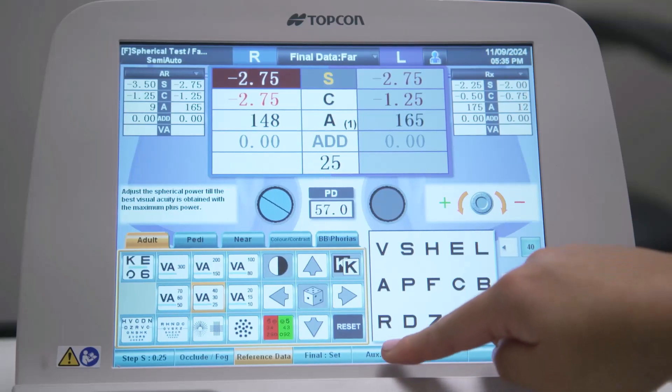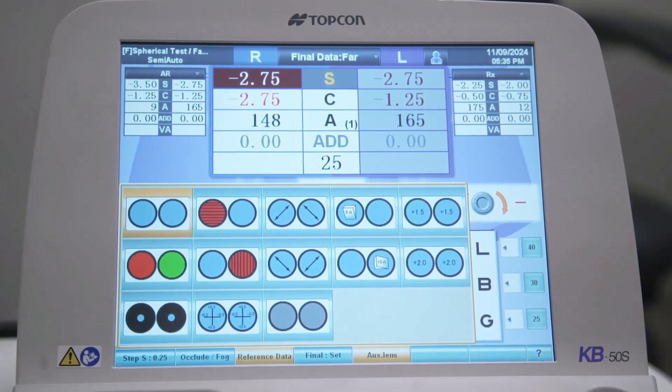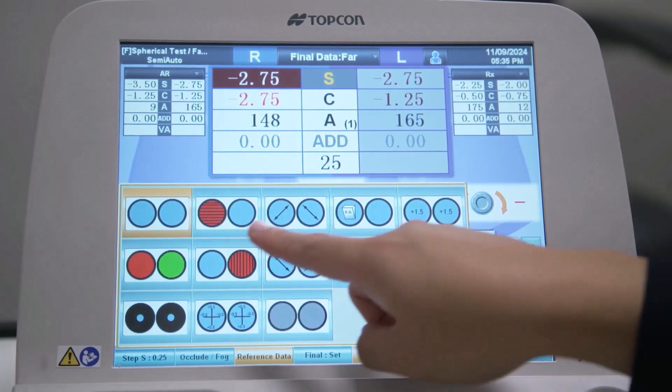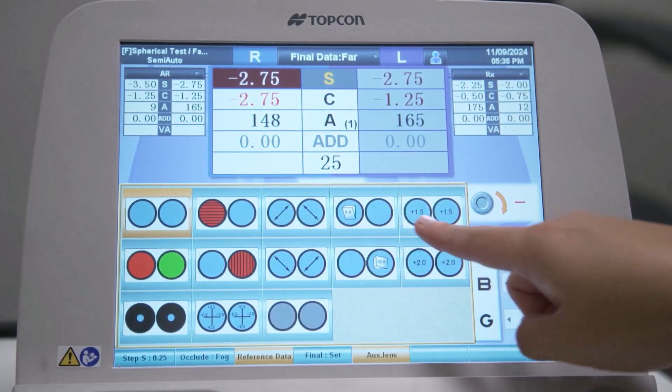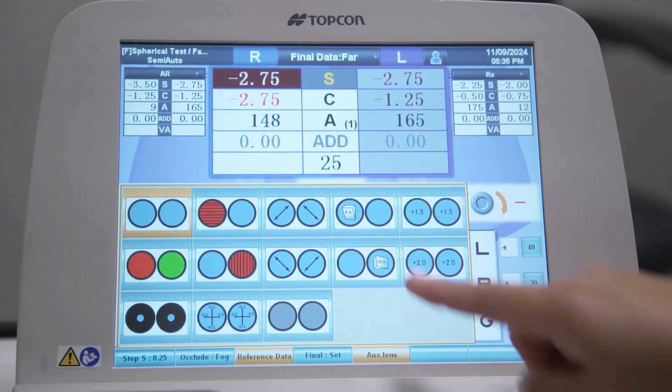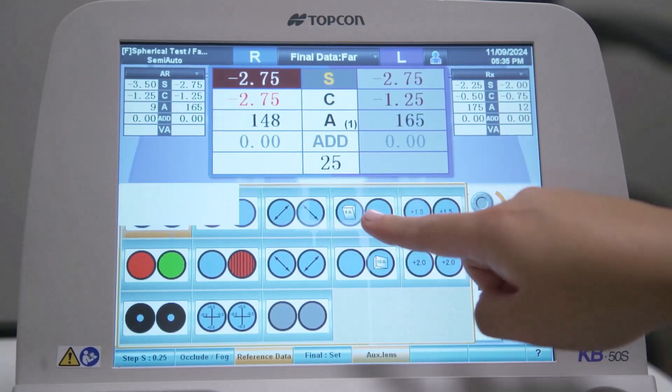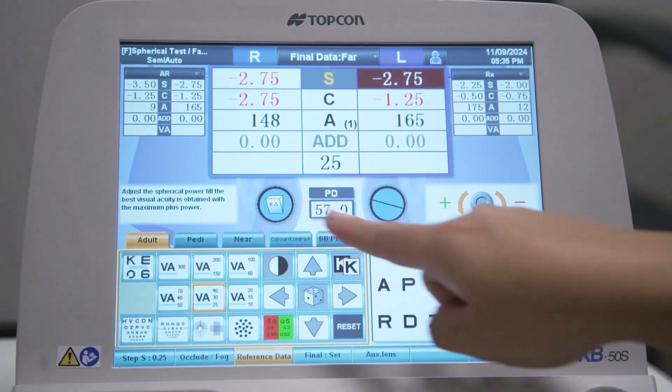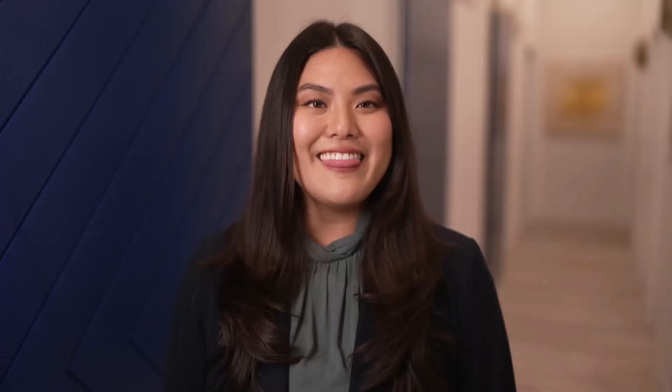The fifth button allows different auxiliary lenses to be selected and loaded into the foreopter head for use in different tests. The auxiliary lens information is updated here. And that's a general overview of the KB50S touch screen. For more information on using your CV5000 digital foreopter system, please visit Topcon Healthcare University.